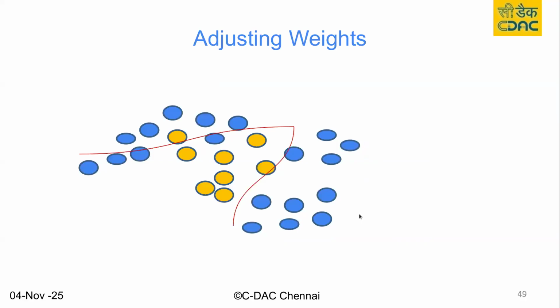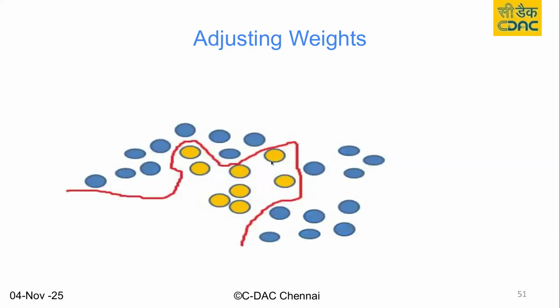Each time this weight adjustment process happens, you will see that we are actually building a neural network which can separate the normal X-ray data points from the abnormal X-ray data points. So the neural network is actually calculating a line which can minimize the error. Minimizing the error means finally a line that can separate the normal X-ray input data points and abnormal X-ray input data points accurately. So that's our objective.